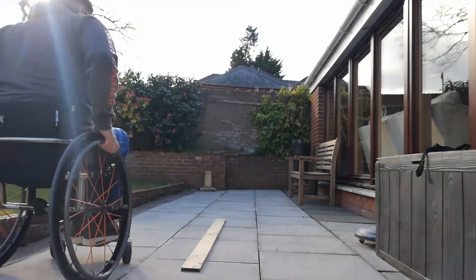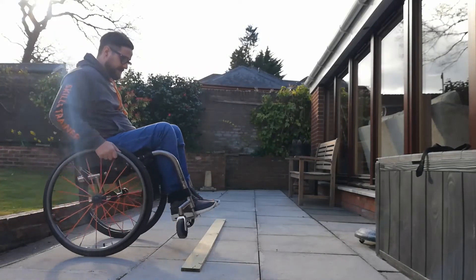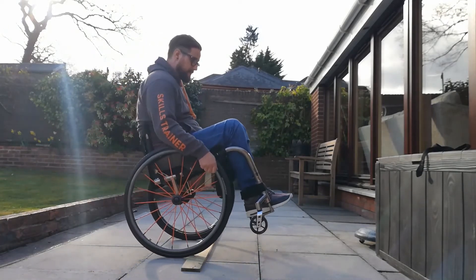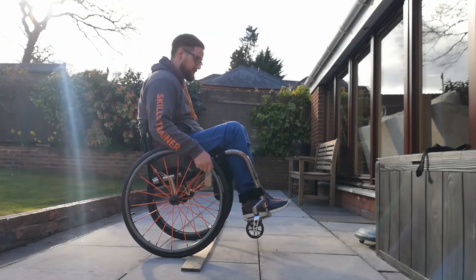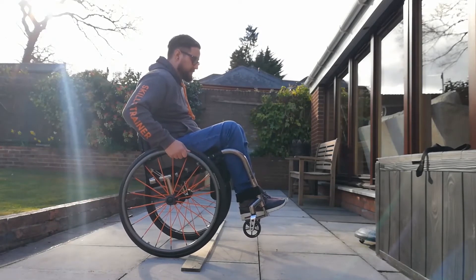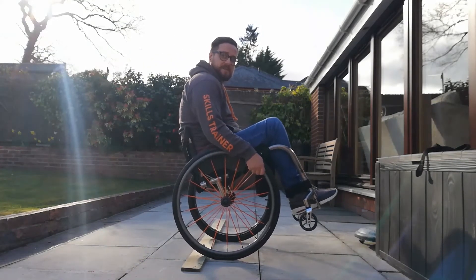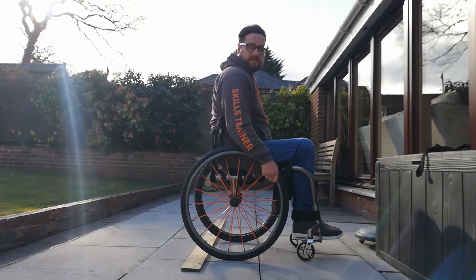To start, as I said, it's finding your back wheel balance and moving slowly forwards towards the object. As you can see, my back drive wheels are locked up against the object. So what we want to do is reset our hand position, slowly roll away a little bit, dropping the front down, pushing up and over the object into a back wheel balance on the other side, and then slowly putting the front down.